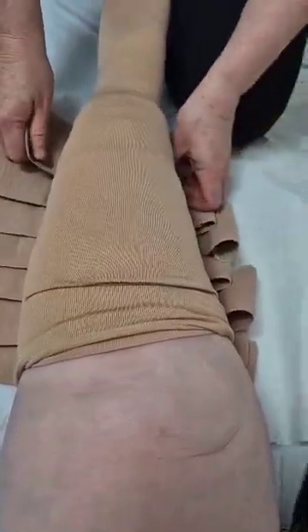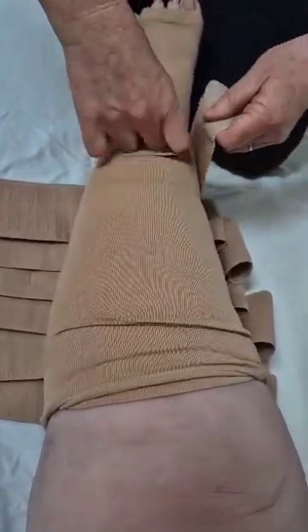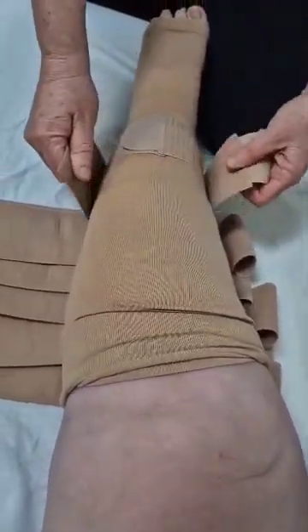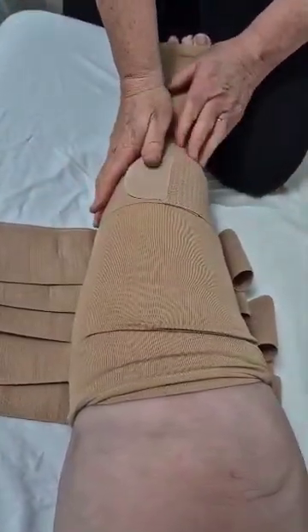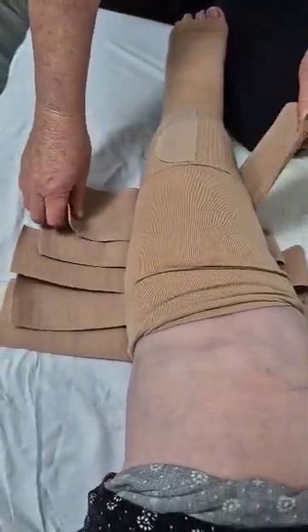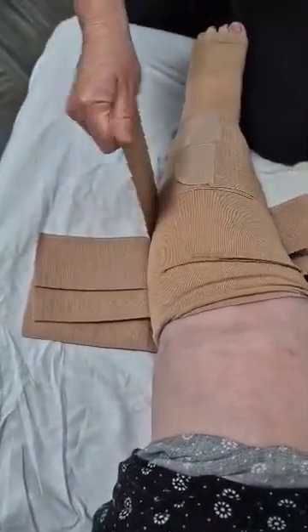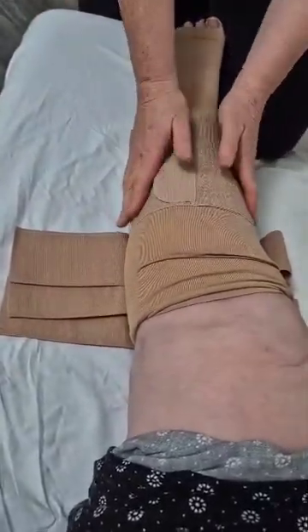and you start at the bottom here, you stretch it out a wee bit, and then you bring the Velcro around. Now it'll be important to have a listen to Jenny and let her tell you if she feels that it's too tight. Should be snug, but it's going to take a wee bit of getting used to. As you go on, you may find that you can tolerate more. So what we're wanting to do: pull, hold, connect. Are we doing all right here?